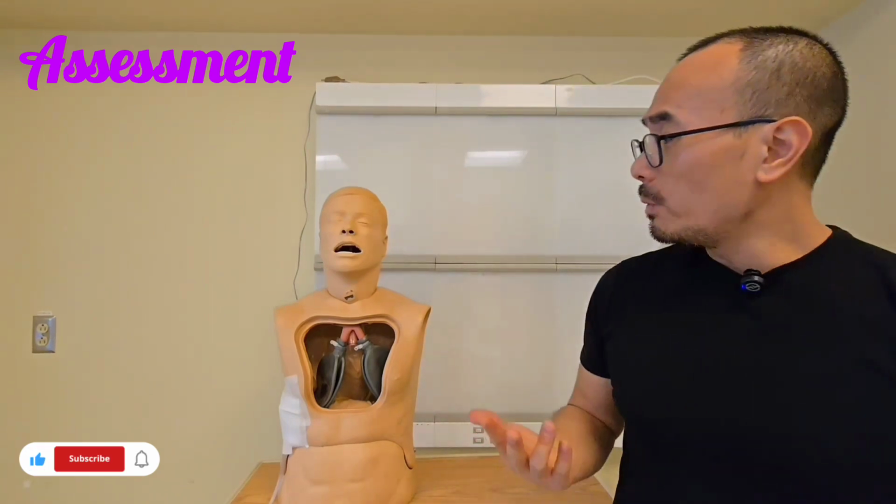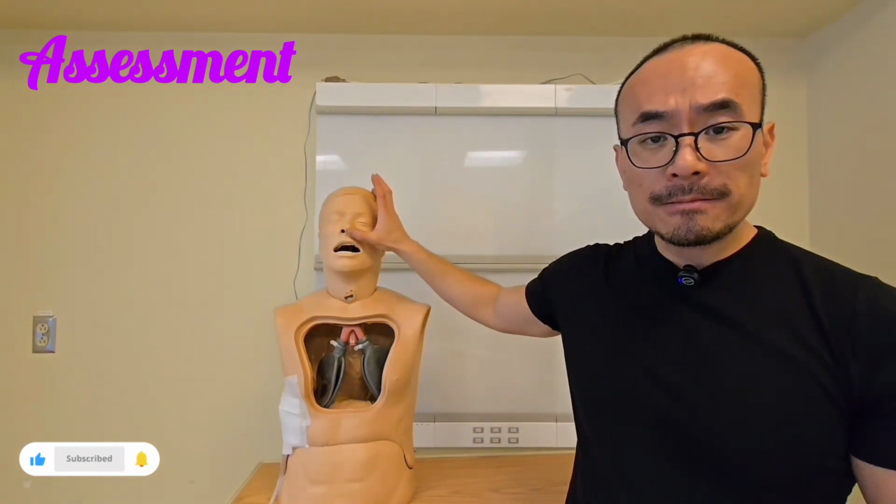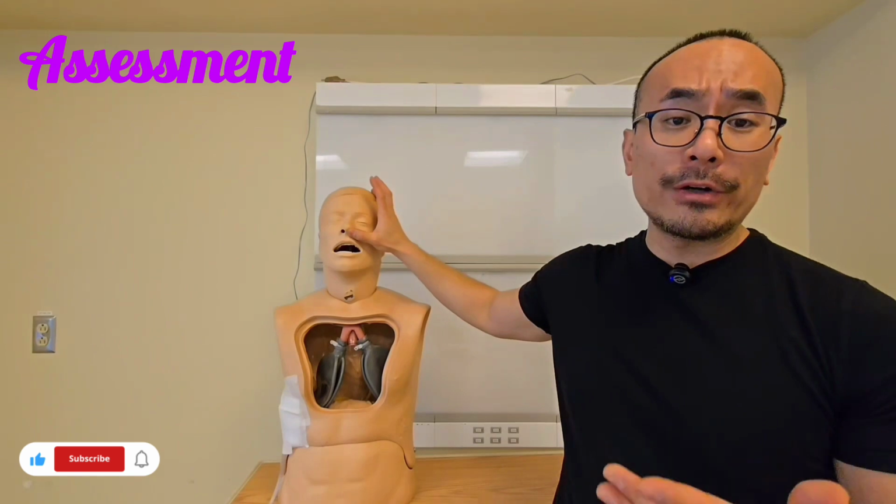All right, team. First, what we need to do is we're going to assess our patient, ensure there's an order for an NG tube insertion. And once you get the order for an NG tube insertion and the patient has been explained the procedure, we are going to assess which one of the two nostrils is the better one for NG insertion. All we need to do is cover one nostril and ask the patient to breathe in from their nose.